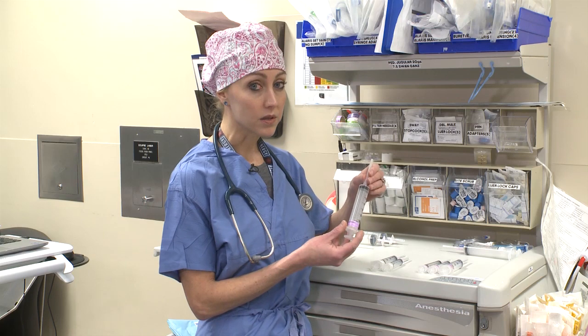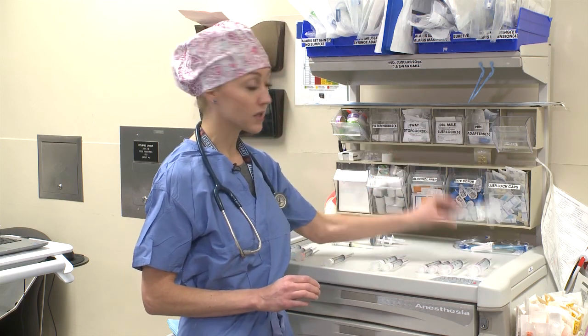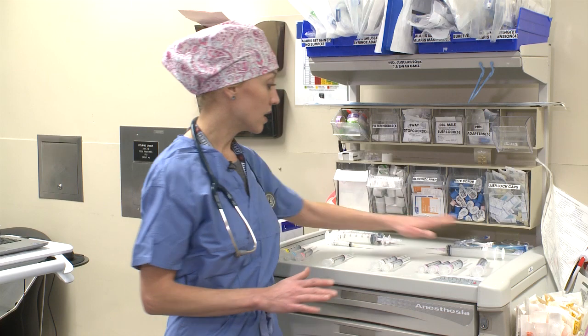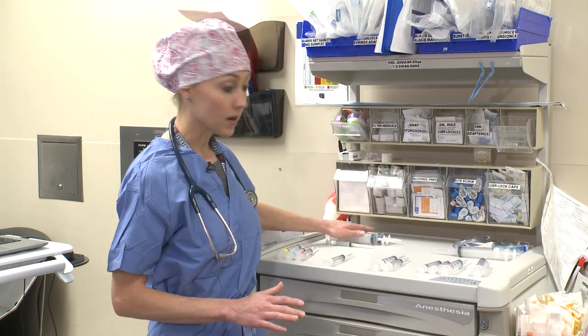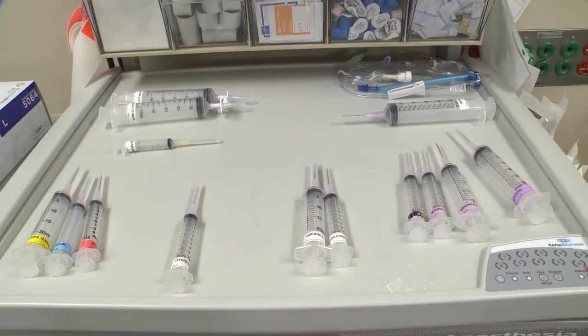Next you're going to create a large syringe of neosynephrine that you're going to give off to perfusion along with two vials of amicar. On the back side, keep your heparin syringe separate from your amicar syringes. Make sure everything is separate so you don't accidentally grab the wrong syringe. So you have a syringe of heparin, two of amicar, and also magnesium — and that is your basic drug setup.